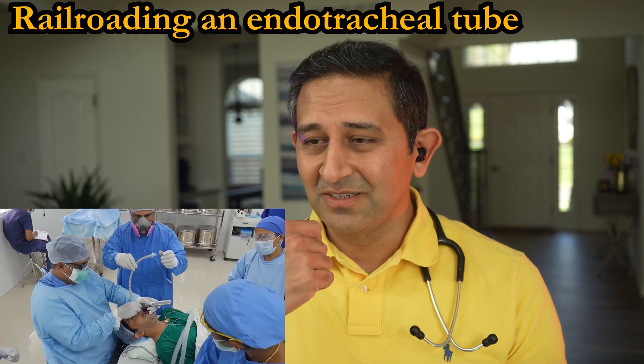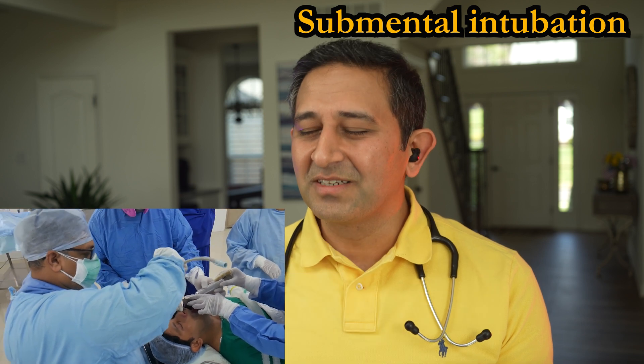It looks like this time the stylet is actually inside the trachea, and now they are railroading an endotracheal tube onto the stylet to go through the nostrils into the trachea. The breathing tube can be put either through the mouth or through the nostrils — sometimes it can also come from the chin but that is very rarely done. The first tube was probably too big, so he is picking a smaller size tube to put in. The tube is going in through the nostrils and is probably in the trachea now.